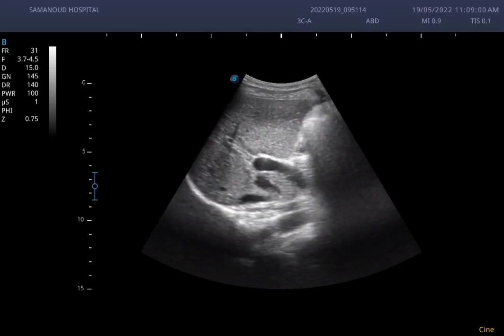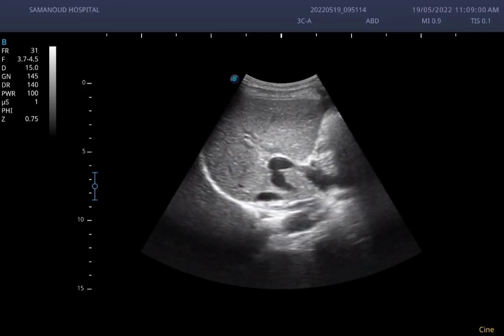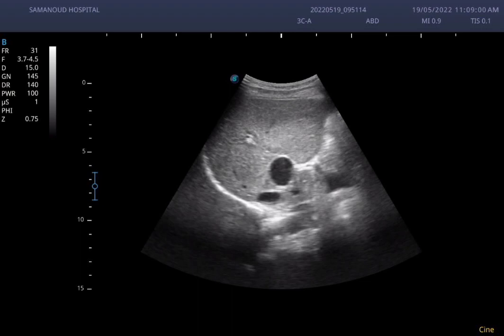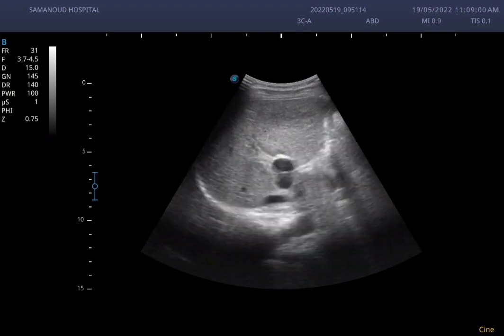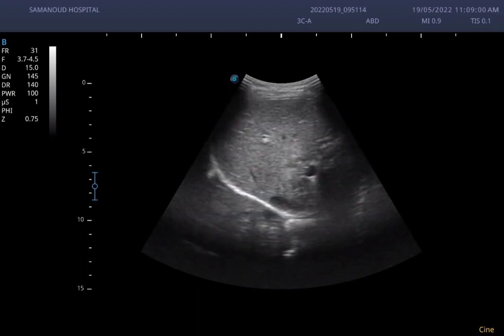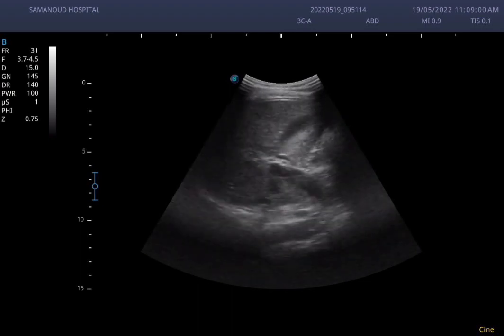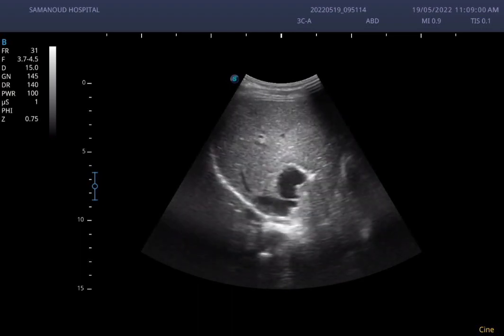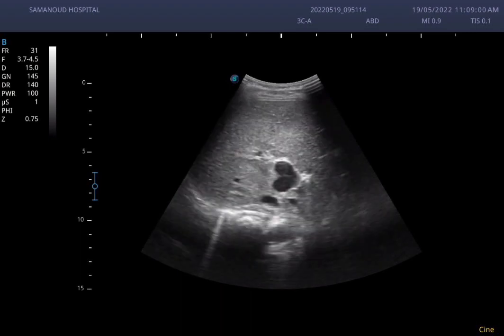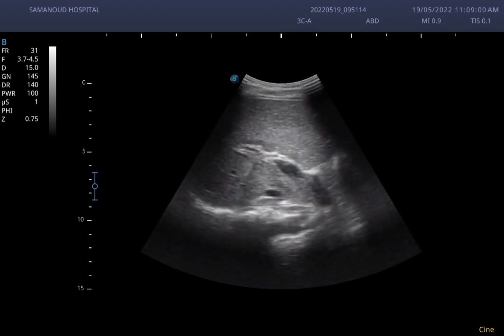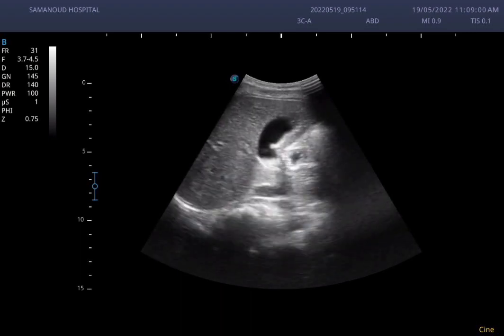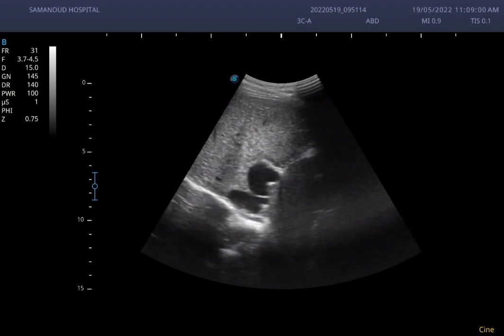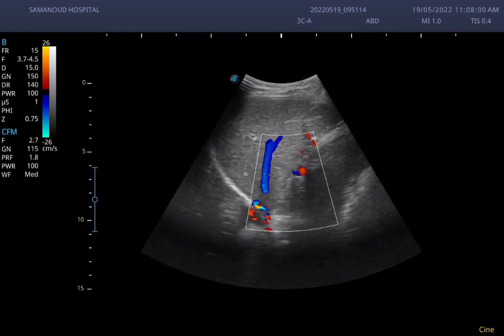Assalamu alaikum warahmatullahi wabarakatuh. Good evening everyone. This is a male patient, 12 years old, coming to our outpatient clinic complaining of abdominal pain. While scanning the liver, we saw an abnormal connection between the IVC and the portal vein.